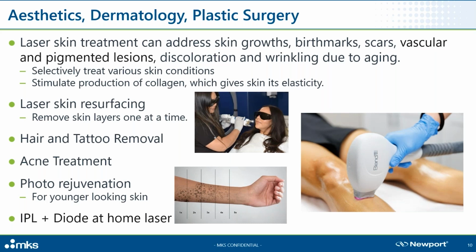So aesthetic lasers can remove wrinkles, treat acne, sunspots, and other vascular defects such as spider veins. They are huge in tattoo and hair removal. Laser resurfacing has been a major tool used in anti-aging treatments. These microburns cause the induction of new collagen formation, which is known to improve elasticity and skin thickness and lessen the effects of wrinkles and aging. Now prices are coming down, so you can even purchase an at-home laser for hair removal.